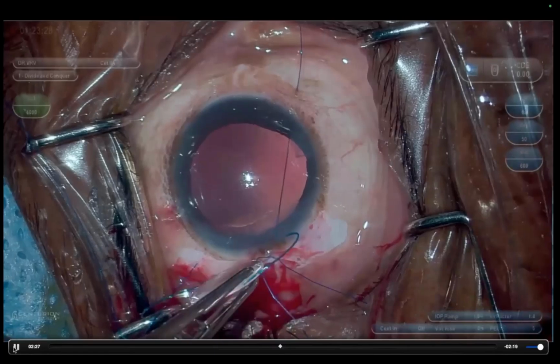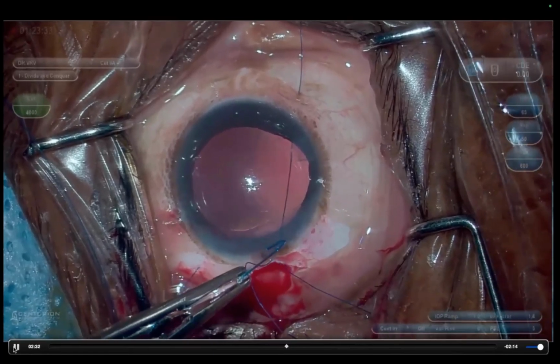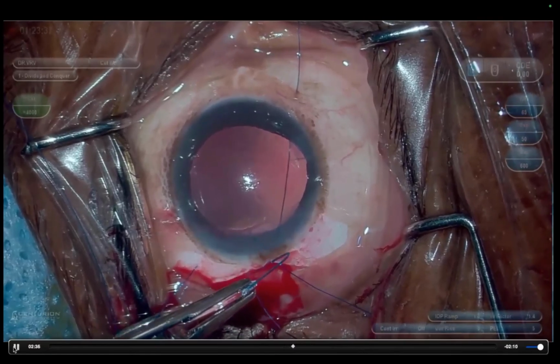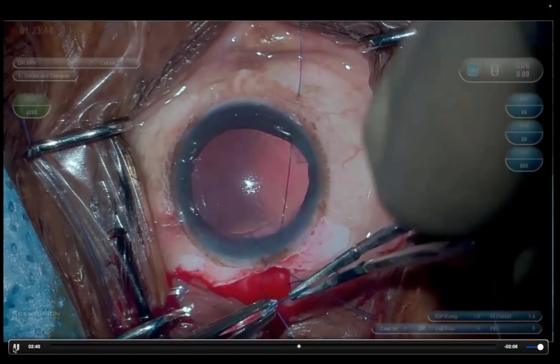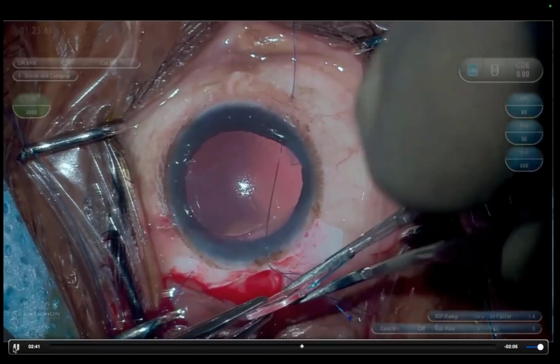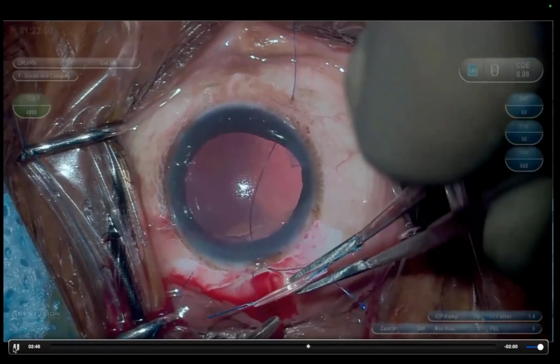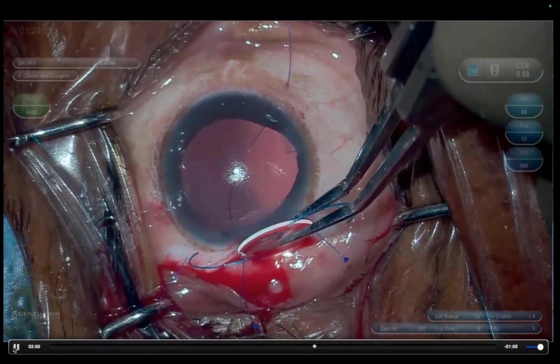And then the right side suture is taken. I usually prefer not to put down the IOL. I use a lens holding forceps to hold the IOL, pass the suture from above to below through the dialing hole and create a flange so that it is larger than the dialing hole itself. The second suture, the left side, goes to the left side dialing hole.